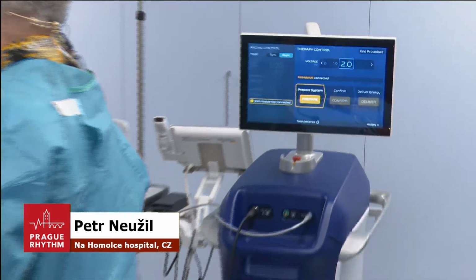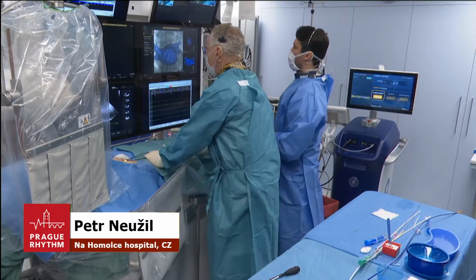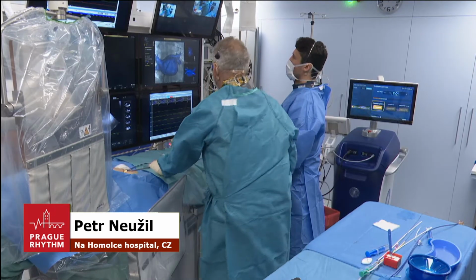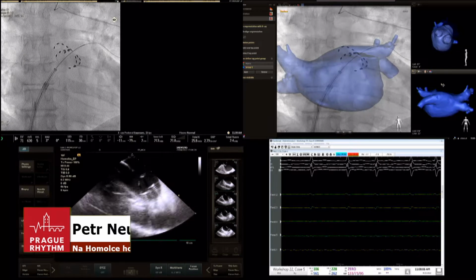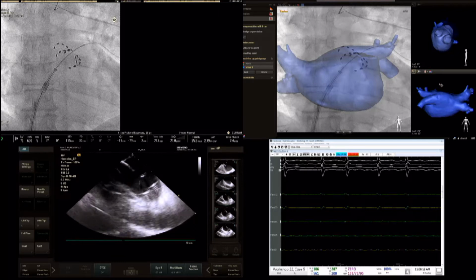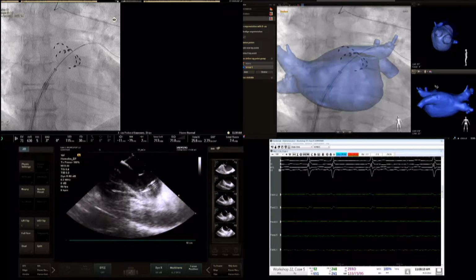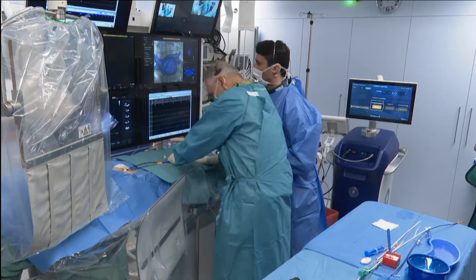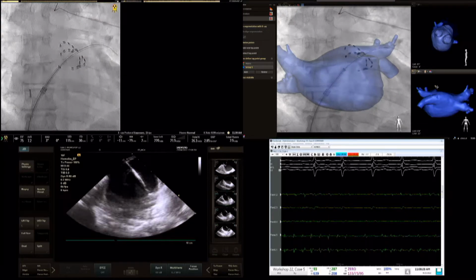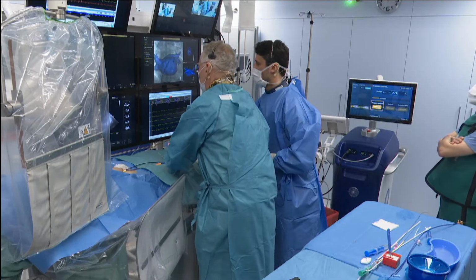So we are now inside the left atrium with the catheter. You can see ICE, you can see fluoro, and you can see fluoro image integrated with CT. On CT, you will see the catheter positioning and catheter shape, and on ICE, you can confirm the contact or just maneuvers with the catheter. Now I will go to the left common position with a basket form. I will put a little bit of fluoro on the active screen. On ICE, you see pushing the basket towards the PV ostia.